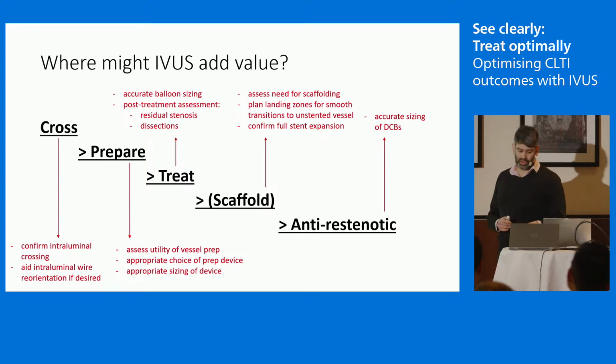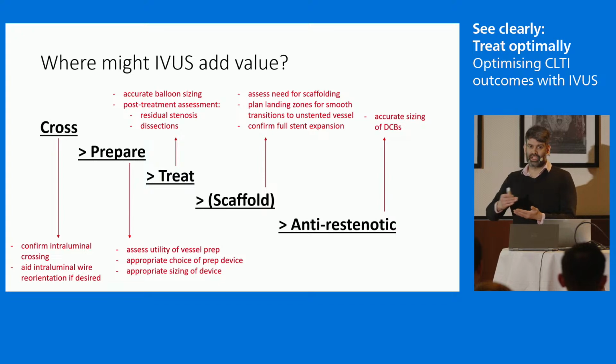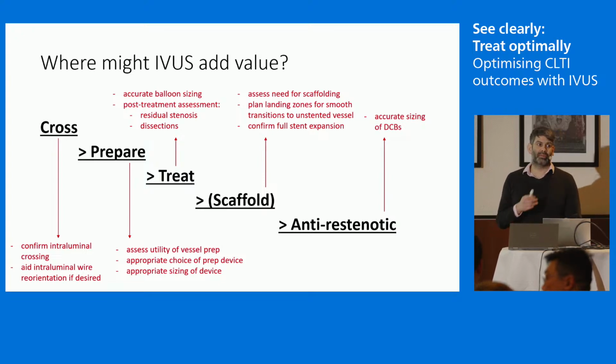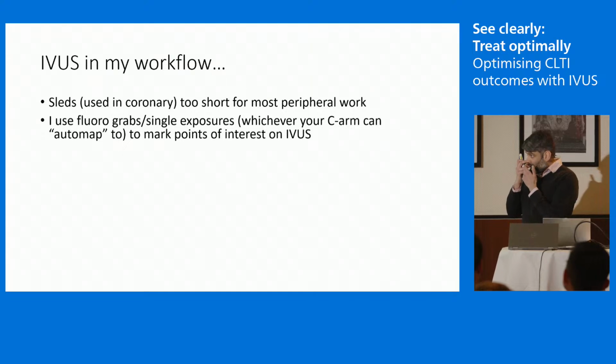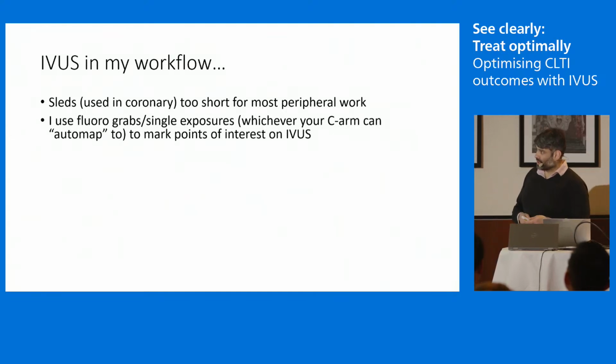I said I'm not going to talk too much, but just keep in mind as everyone shows you cases, which step of those stages people are using the IVUS in and where they're finding it useful, and maybe that's where you will also be able to find it useful in your practice. In my workflow, everyone develops their own way of using it.